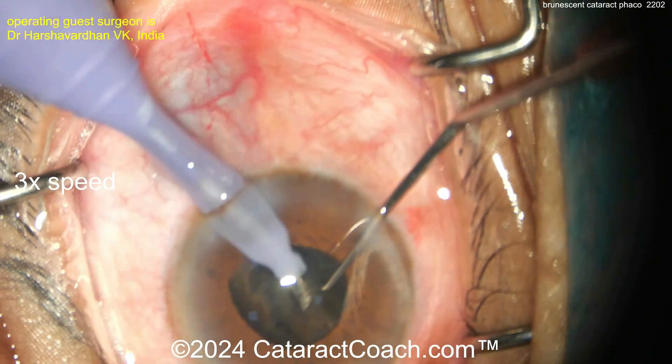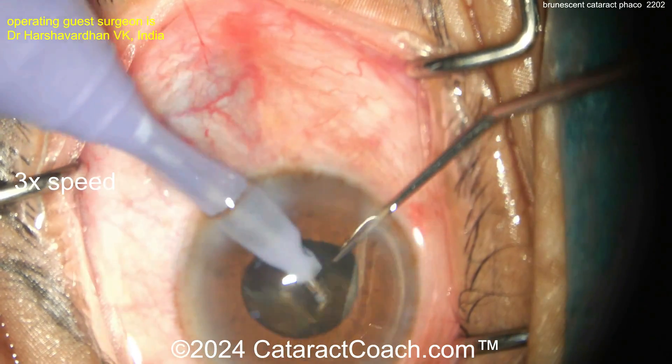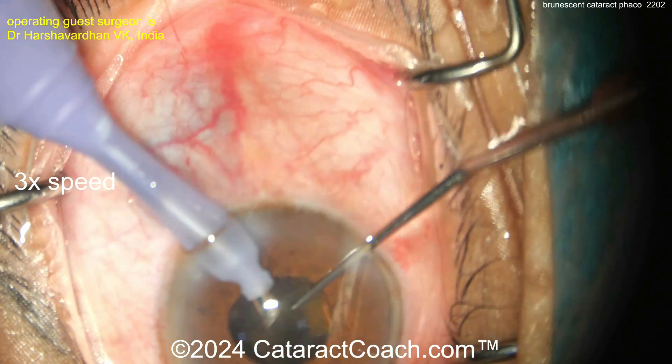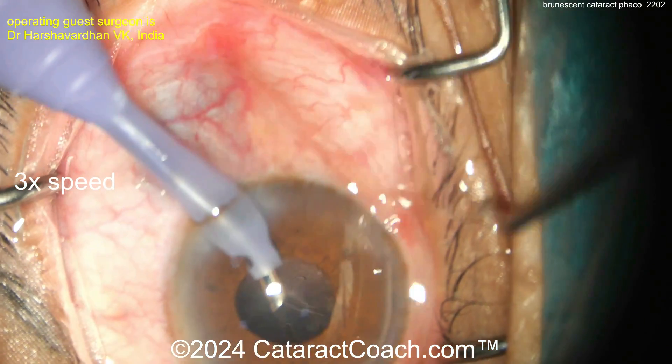The surgeon is doing a fantastic job staying in the center of that smaller pupil and aspirating all these thick pieces. Also be careful of a phaco wound burn when putting this much phaco energy in the eye. The surgeon is doing a great job floating within the incision — beautiful technique to avoid a wound burn. Nucleus removal complete.